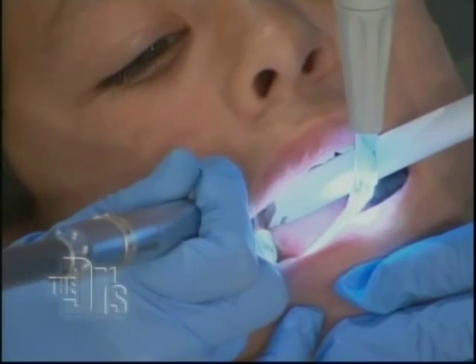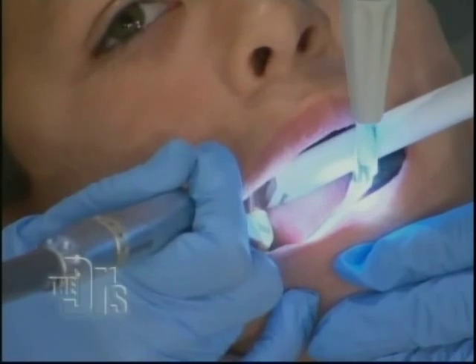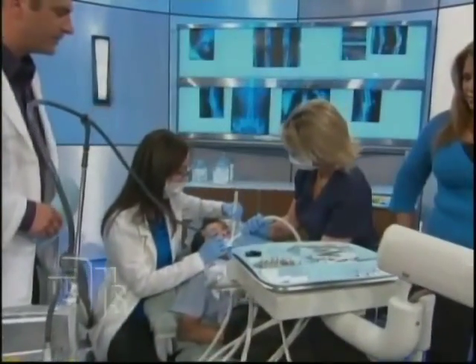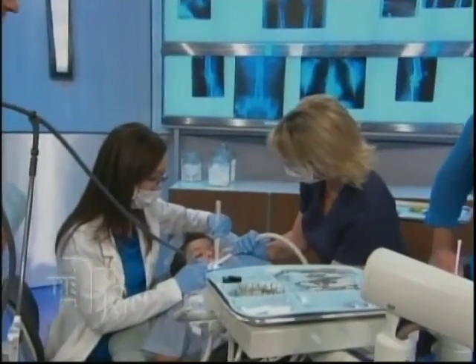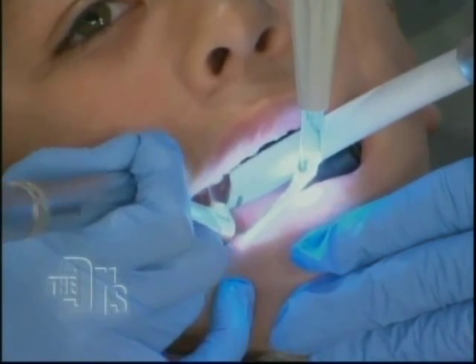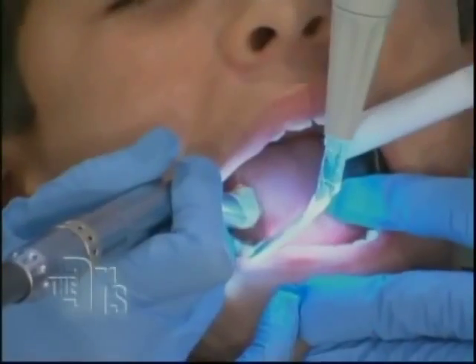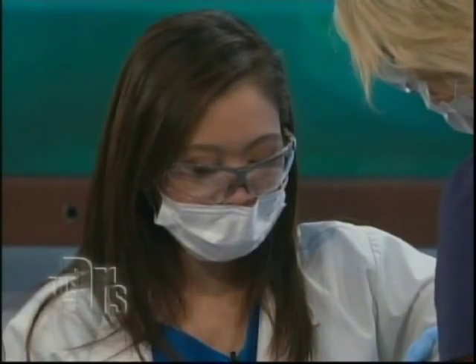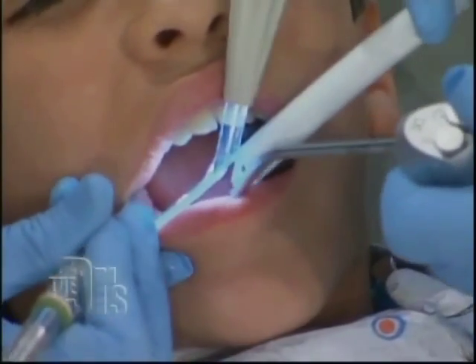So this is the best and easiest way of prevention — to take the decay out in an earlier stage without having to get a shot. The laser is inside this machine here, and it comes out as a beam of light, and it breaks off the water molecule. That noise right there is the bead. That doesn't hurt at all? No. The water lase is like a high-power water fan that tips away the decay and ends up removing it. What's really nice is you can have a very conservative restoration just by using water to take out the cavity. Once I know I'm back into hard tooth structure, that means we removed all of the cavity.